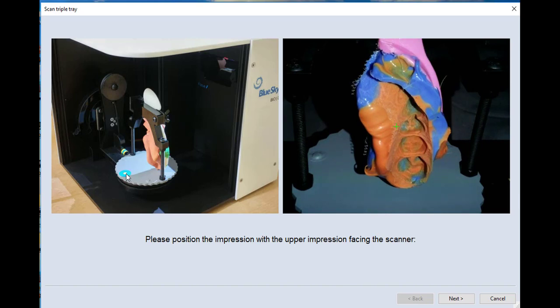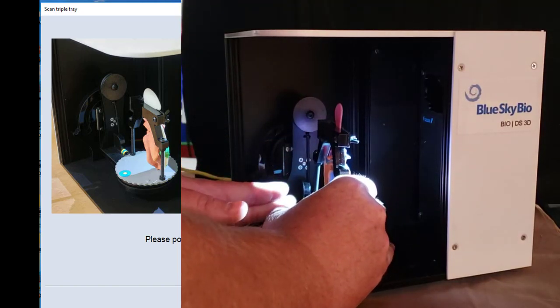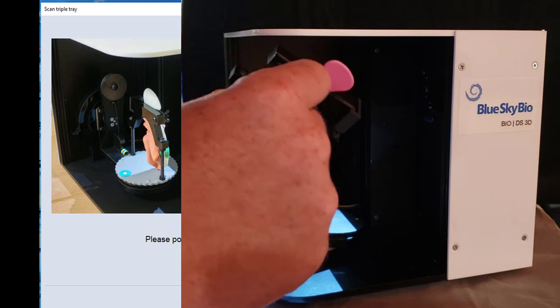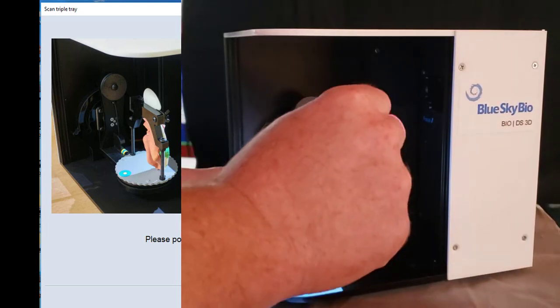What I want to point out is that you're going to take the impression holding plate and orient it with the blue and yellow dot facing directly away from the camera, and with the maxillary side of your impression facing towards the camera. So if you look at the impression scanning plate, this is simply a little hinged piece with a wing nut. You just put the handle of your tray into this and then tighten down the wing nut.